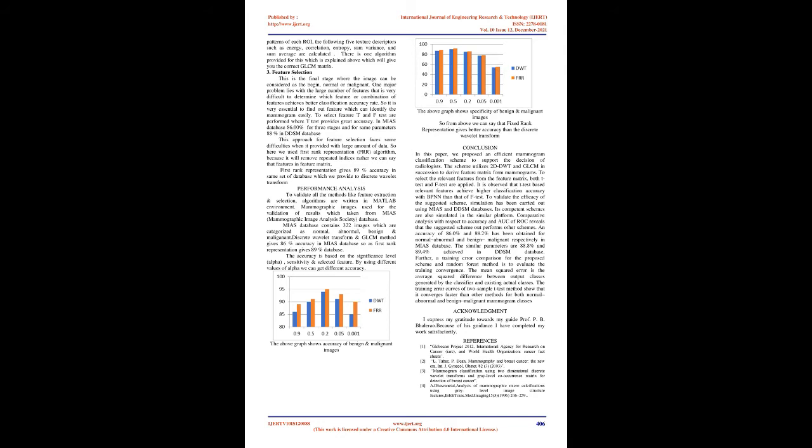This property leads the wavelet to extract better texture information from the mammographic ROIs. Given a continuous, square integrable function f(x), its wavelet transform is calculated as the inner product of f and a real valued wavelet function ψ(x), and it is given by C.